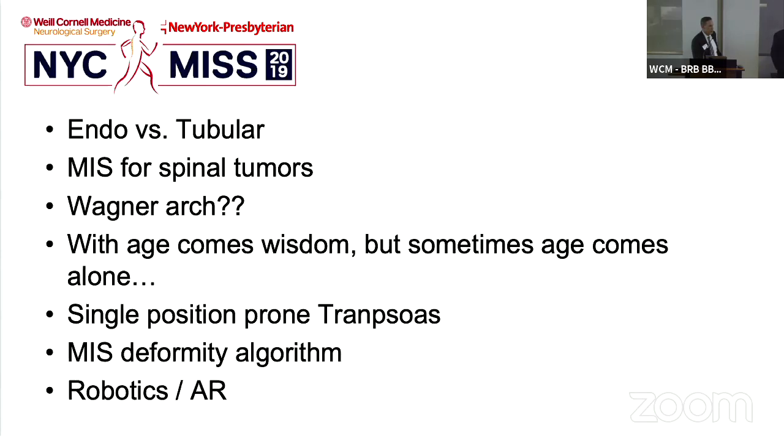The thing is that to have 3D vision, you need the glasses. I'm talking about the exoscope now. Yeah. But you need to have your screen right in front, because if you move a little bit, then you lose the 3D. And during surgery, you always move your head. So sometimes you see 3D, sometimes you see something a little bit blurry. I think that depends on the system, though. We use the Olympus, and that seems to be. I have noticed that. They are from Olympus, yeah. Yeah, I have noticed that.